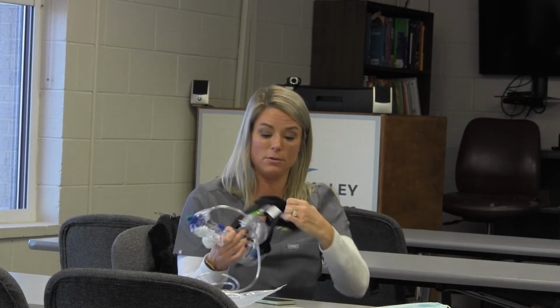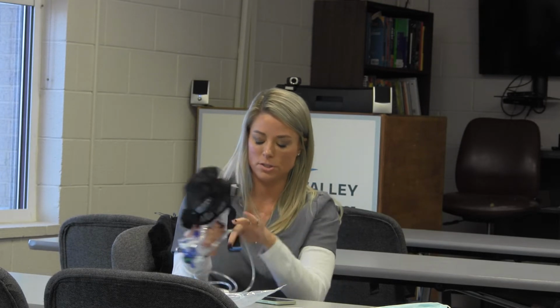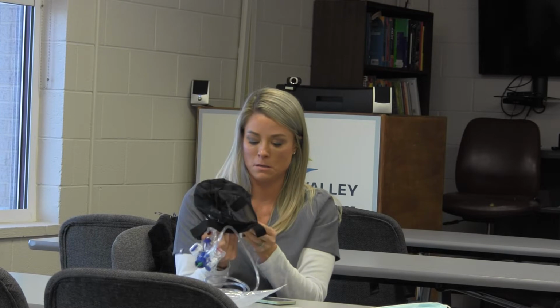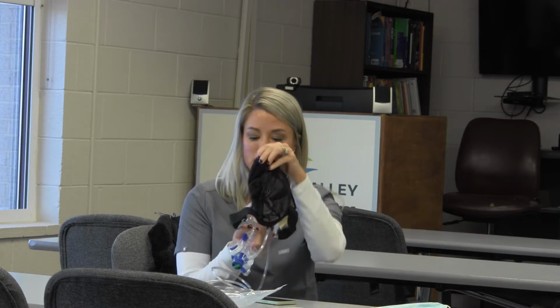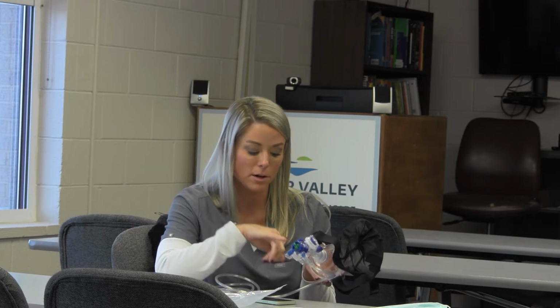If they don't feel comfortable with putting this on their head and putting down the straps, you don't have to do that. You can just hold it up to your face or to their face. They can get a tight seal that way, above the bridge of the nose and under the chin. The next thing you want to do is look at the manometer right here and make sure that it registers their breath, because in order for the device to calibrate, it needs to get a reading of what their breath is. So you want to make sure that needle doesn't go below the 5 o'clock position there.